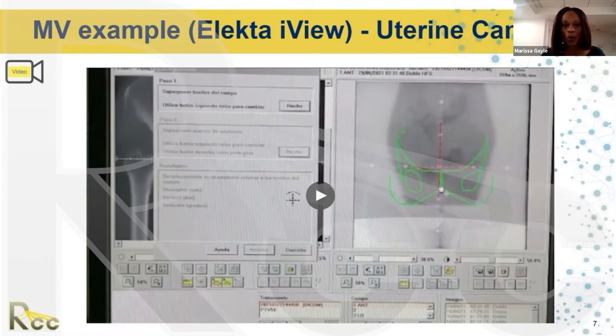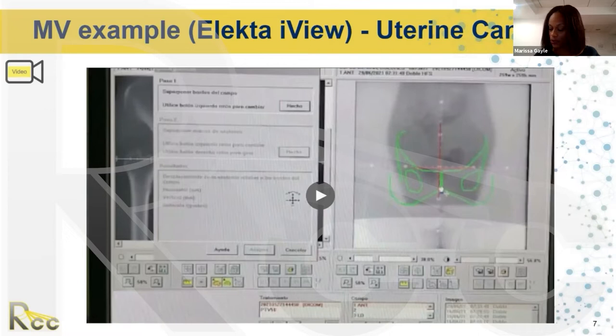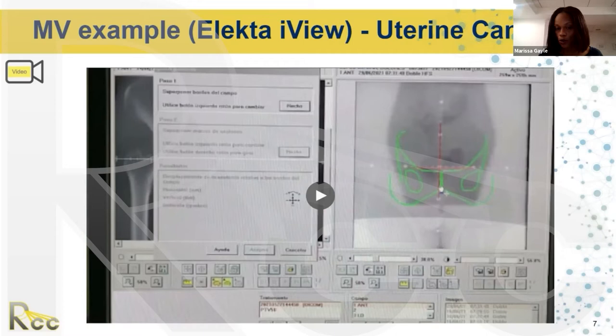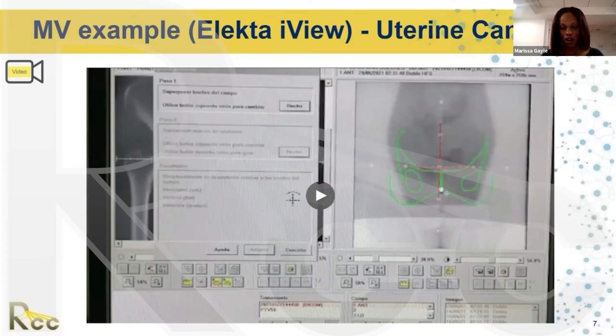On an Elekta, the first day film is an MV image. You have to delineate the graticule and structures of interest on the DRR. Once done on the first day, it's sticky and will be there for remaining treatments. You overlay lines on the MV image, make sure the graticule and field borders are on first, then do your bony anatomy match. On the Elekta, you do the bony anatomy match, determine the shifts, go into the room, apply the shifts, and then re-image the patient.